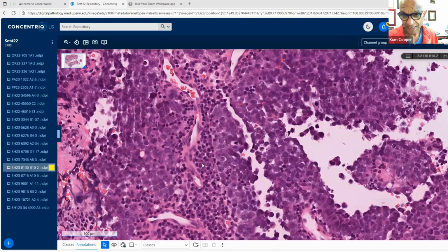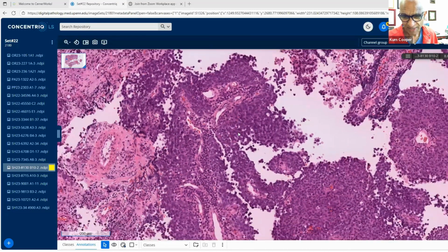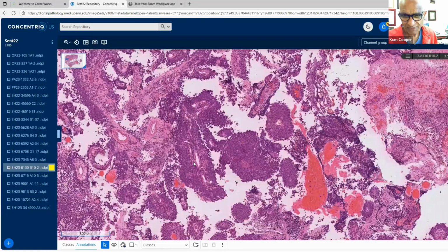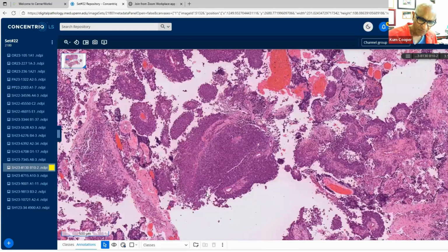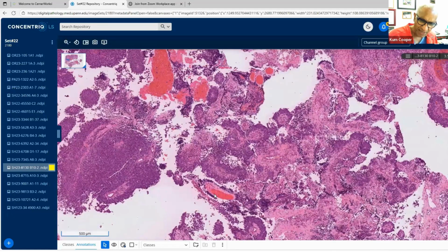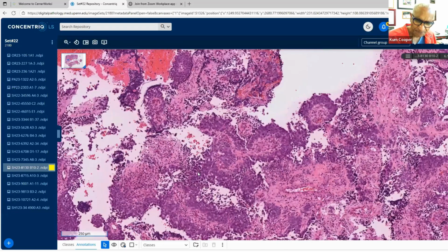This literally looks papillary, right? I was showing you this looks papillary, and that probably made you a little resistant to considering melanoma. But these pseudopapillary structures, because of these loosely cohesive cells, and these islands break away with their fibrovascular cores, give you this pseudopapillary look.